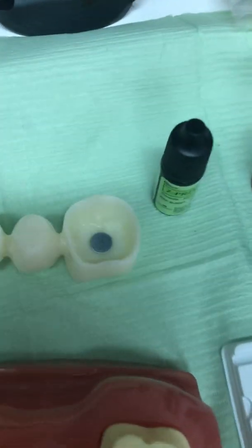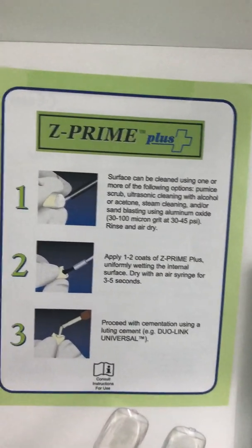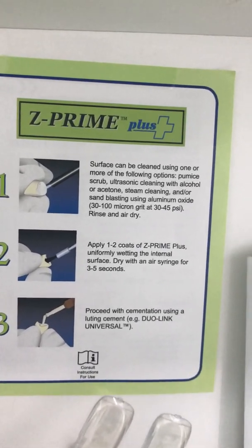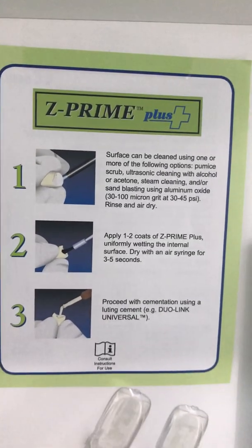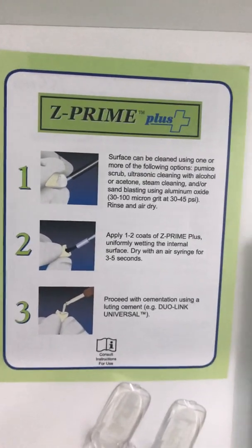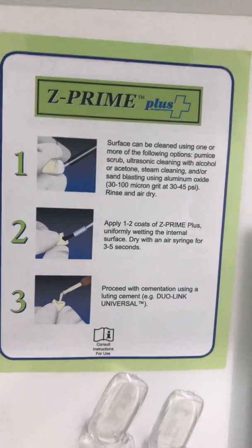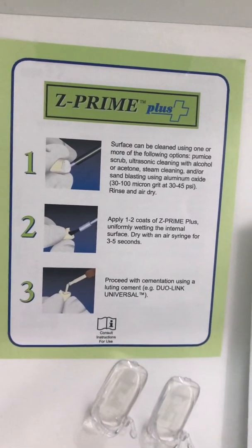We then use a zirconia primer — Z Primer Plus — applying two coatings onto the inside of the crown on a very dry surface. We sandblast, rinse, and air dry, then apply one to two coats of Z Primer Plus to wet the internal surface, and then dry it clean.